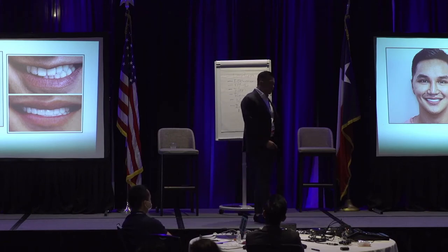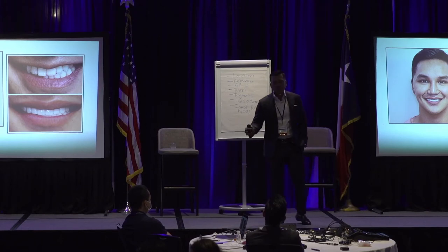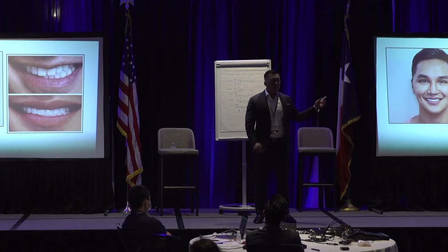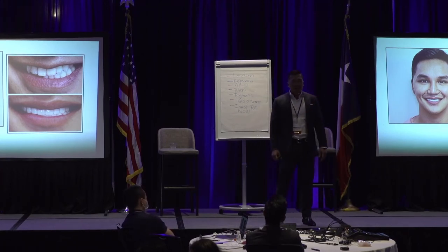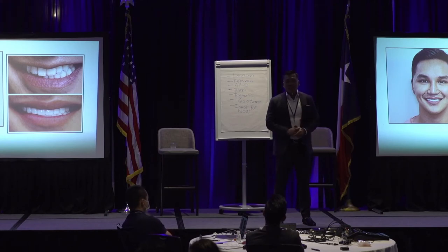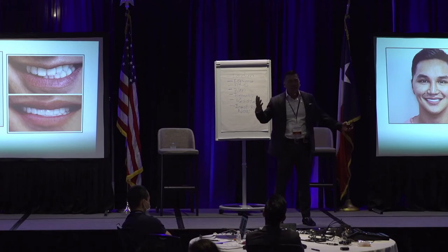So the digital workflow process is all analog steps. I'm just telling you that all the analog workflows, but we get it so much faster and we can visualize things. But what I was saying is, if you did this in an analog world, oh man, when I first brought in my ceramist, he was messing up my cases. He was taking the model and putting that denture plate on there, and he was aligning it like that. So they were coming back to my case, and I was like, what the hell? He's like, look, I'm making it straight for you. I was like, no, not everybody's jaw is like that.